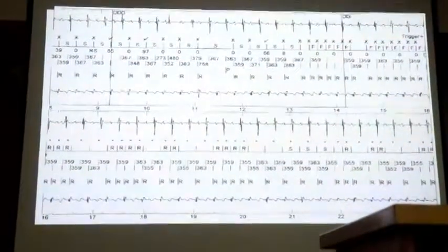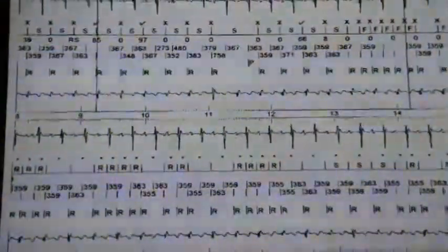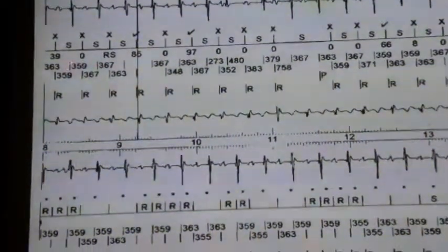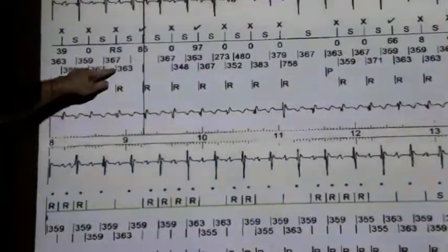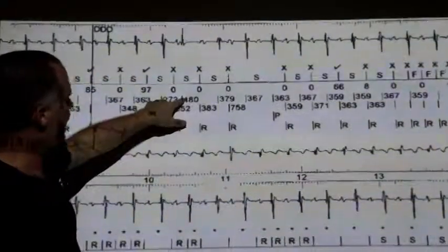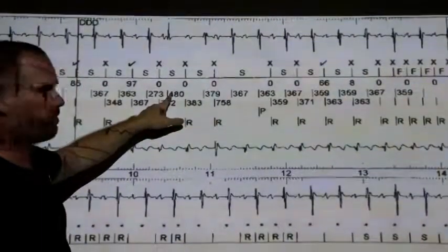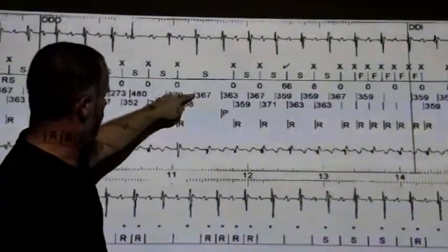It's just like loads of markers, it's like it's too much, but work through it, it's okay. Atrial channel, ventricular channel, and then these are the markers, these things here. So this is the A marker on this device: V marker, A, V, A, V, A, V, A, V, A, V. Early A, a bit of delayed AV nodal conduction, interesting, but it's a very early A.